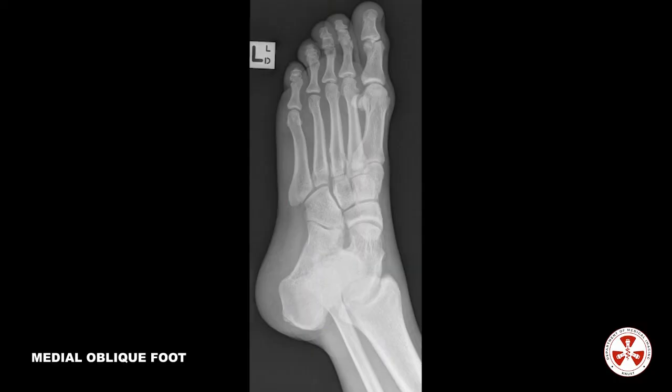The medial oblique must clearly show the tuberosity of the fifth metatarsal, the cuboid, and an open sinus tarsi with proper bony detail.